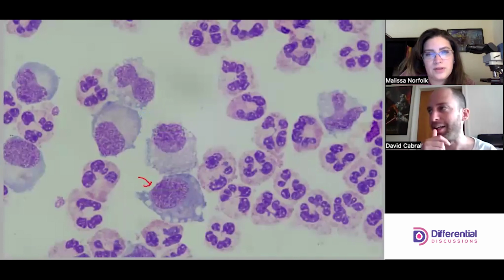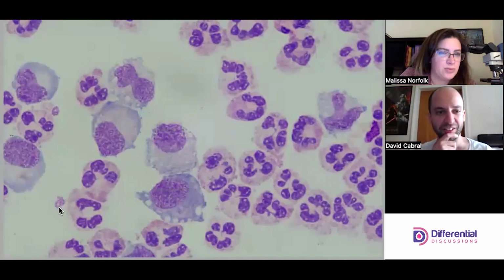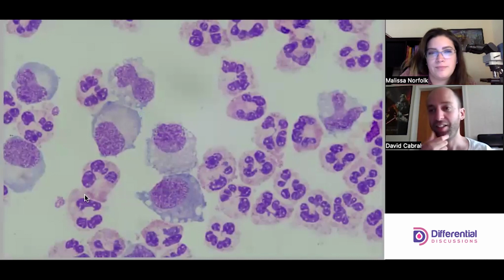I would not get into an argument in the lab about what this is, personally. That's my intuition. It's got similar coloration to these guys, but that one is a jerk, and it's somewhere between the morphologies, isn't it? Based off of the cytoplasm, I'd probably go with mono. But yeah, he's not a nice cell. Tough calls. This is not a perfect science.